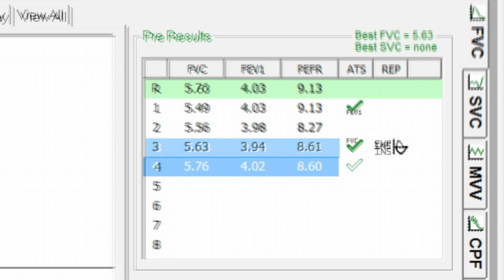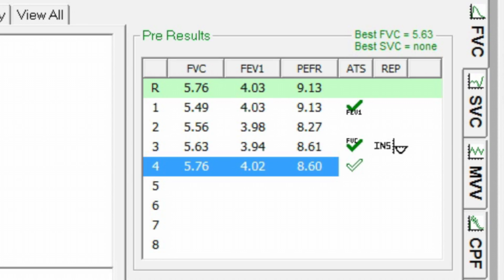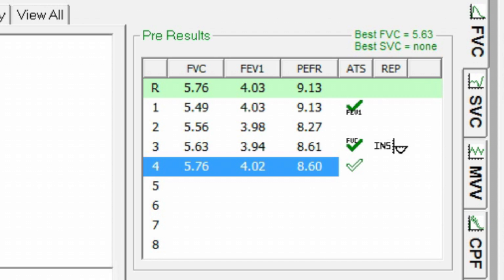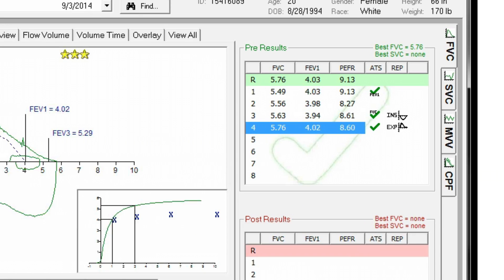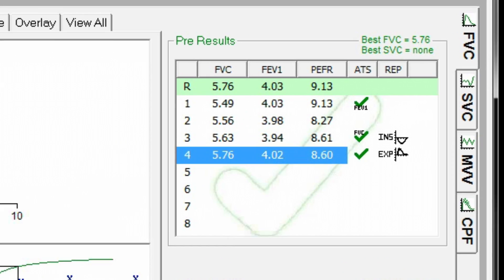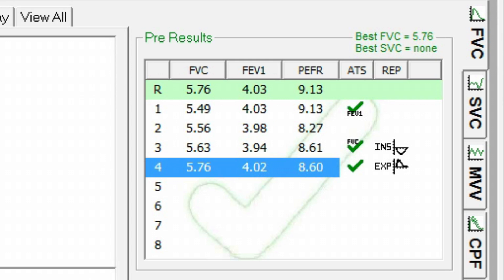A solid checkmark indicates which efforts also meet reproducibility. When full ATS reproducibility has been achieved, a large checkmark confirms that good flow volume testing has been accomplished.